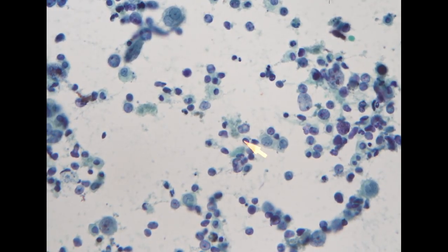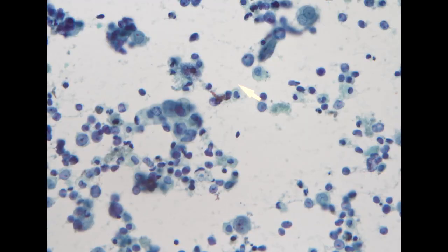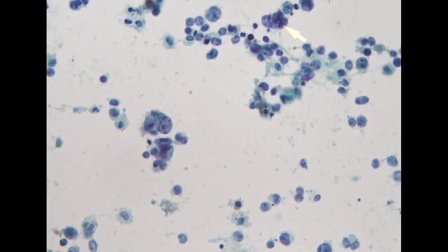So in this specimen, it is kind of complicated because you see scattered gigantic cells. The chromatin pattern is relatively pale and loose, and you see other hyperchromatic cells in a loosely cohesive cluster or single cells.